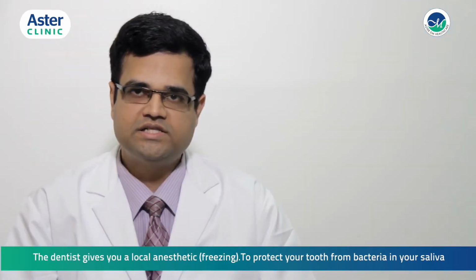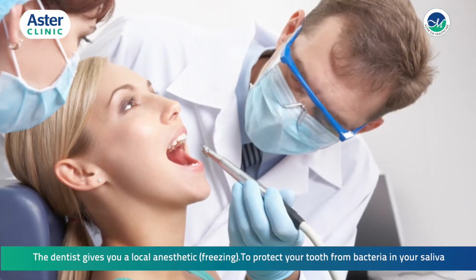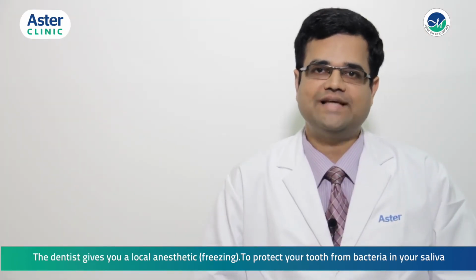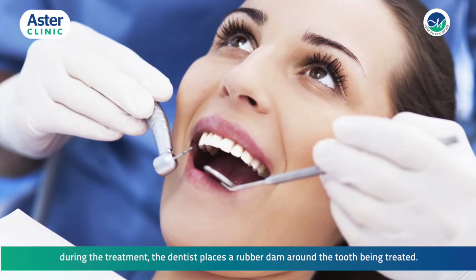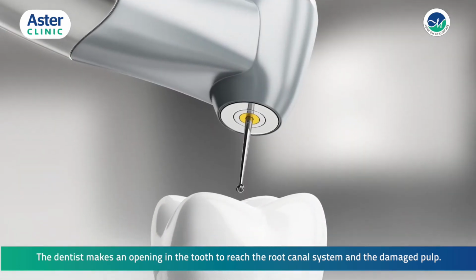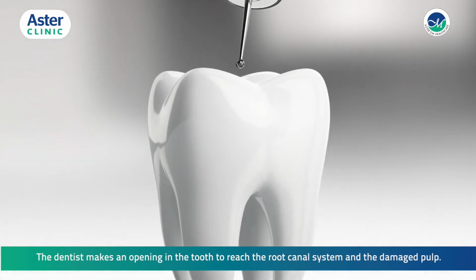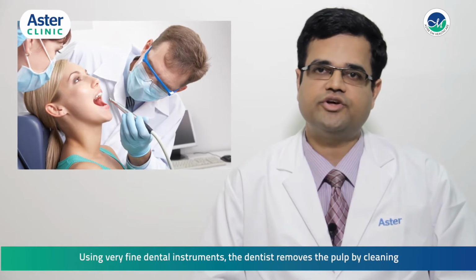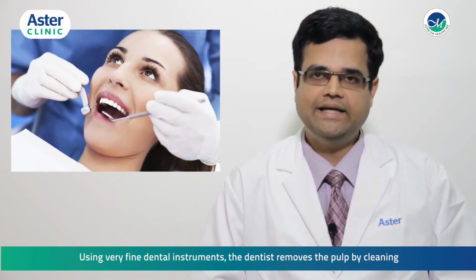How is a root canal treatment done? The dentist gives you a local anesthetic. To protect your tooth from bacteria in your saliva during the treatment, the dentist places a rubber dam around the tooth being treated. The dentist makes an opening in the tooth to reach the root canal system and the damaged pulp. Using very fine dental instruments, the dentist removes the pulp by cleaning and enlarging the root canal system.